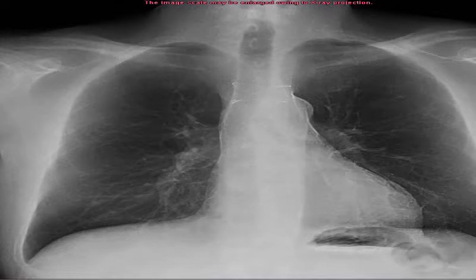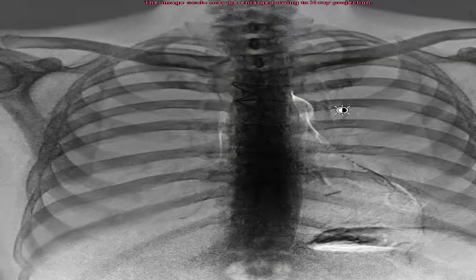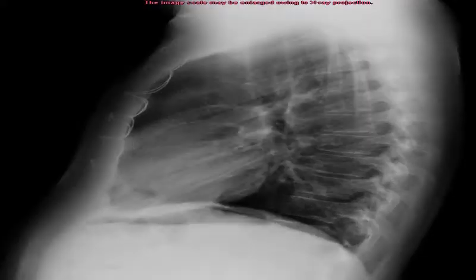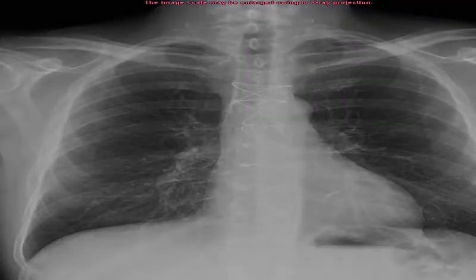After my open-heart surgery, here are some X-ray images showing the wires they used to wire the sternum back together. You can see the wires here — this is a side view showing how they use double wires to wire your sternum back. This is where they cut it.